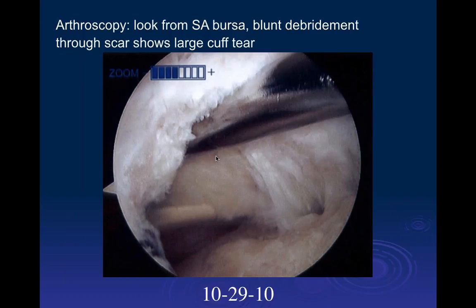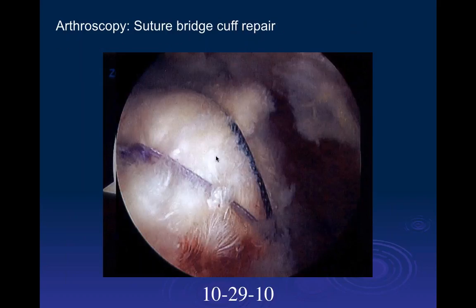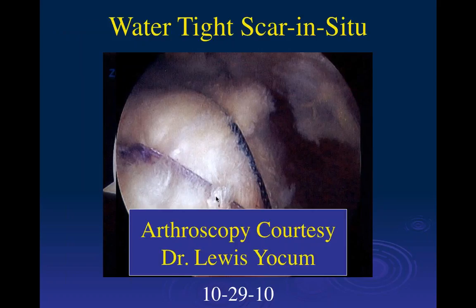So they went in and debrided it on 10/29/2010 and did a primary repair. The suture anchors are over here, and these are the stitches bringing the distal end of the tendon back over to fix it.